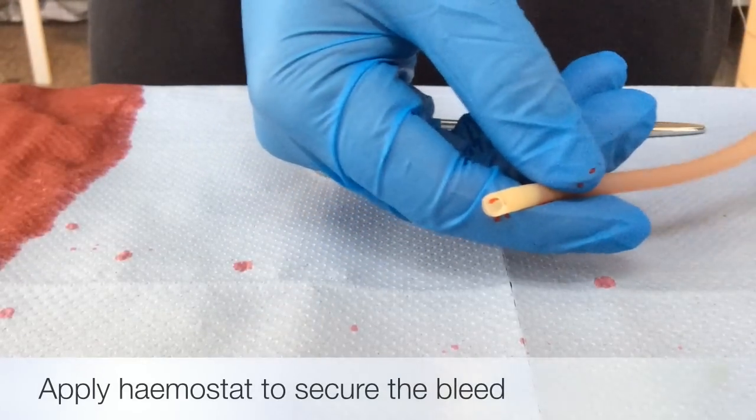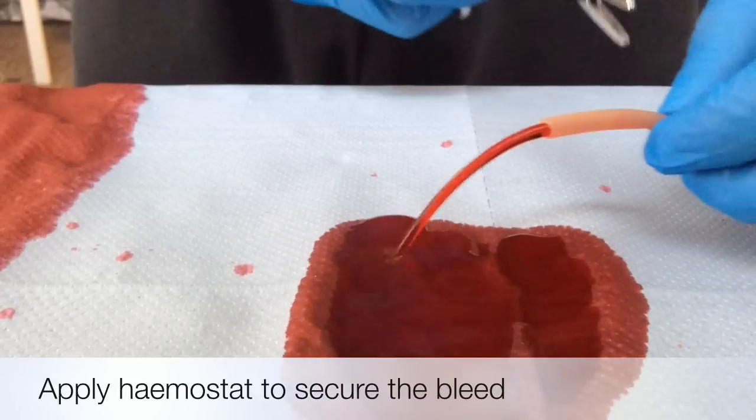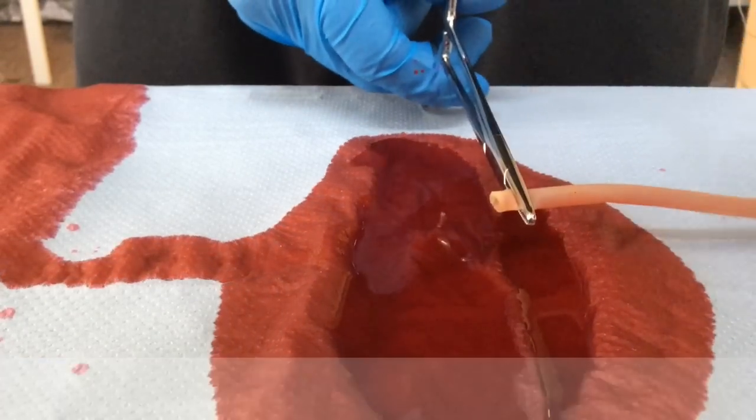When you are presented with a bleeding blood vessel you have to apply pressure to it. This can be either with your fingers, or if a hemostat is present, clamp it off like so.